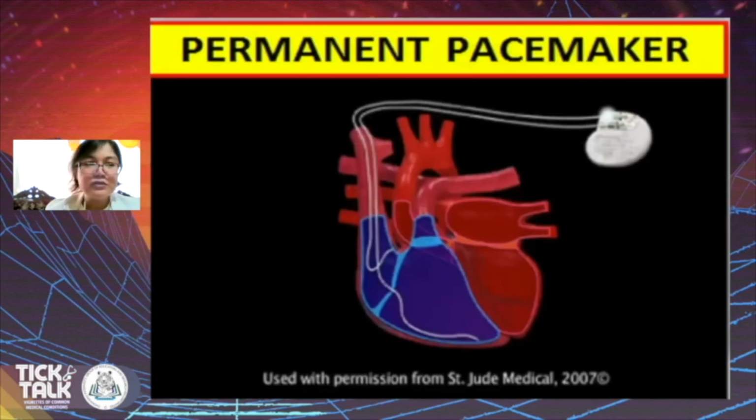Finally, in patients who have very, very slow heartbeat, in patients with very, very long pauses, sometimes it's necessary to give them some help, give them some aid in the form of your permanent pacemakers. So instead of the actual SA node generating the electrical impulse, these patients with severely diseased SA nodes with severe and very advanced blocks will necessitate the help of these extraneous therapies. So our pacemaker here, as shown in this picture, has a pulse generator or battery with leads attached to it going to your RA and RV to effect proper synchronized contractility.